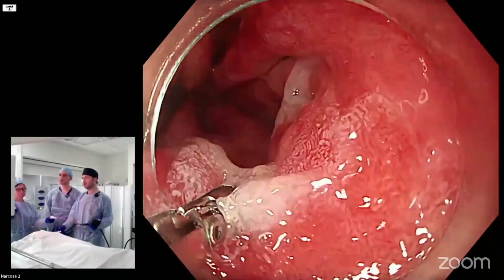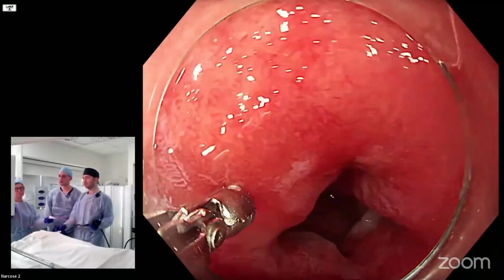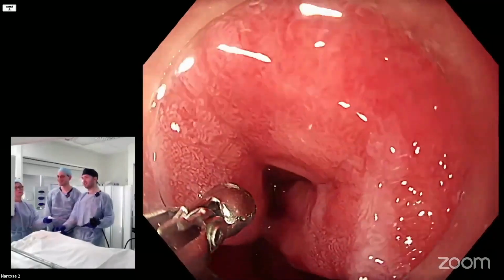And where is another gastric fold where we can demonstrate that? Here are these vessels up here, right? And here is the top of a gastric fold. Here, the biopsy forceps is very useful for pointing. Here is the top of a gastric fold.